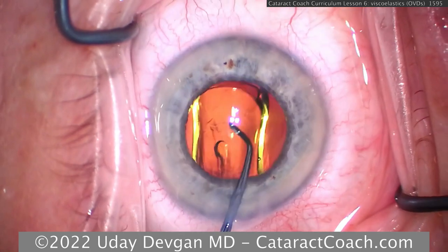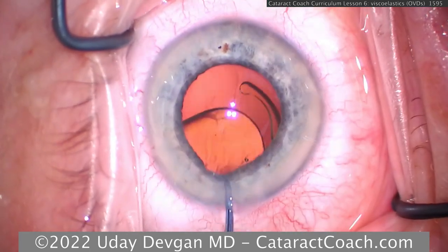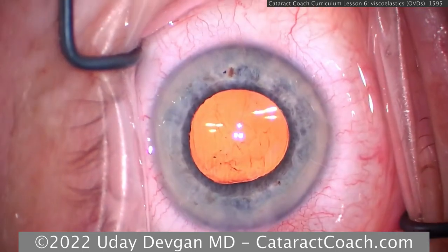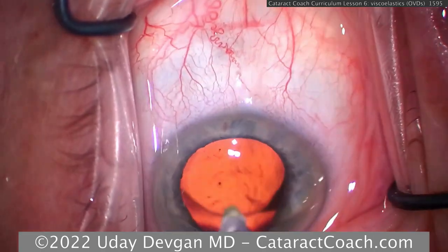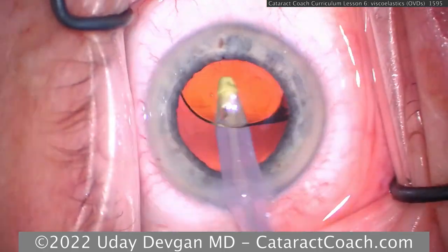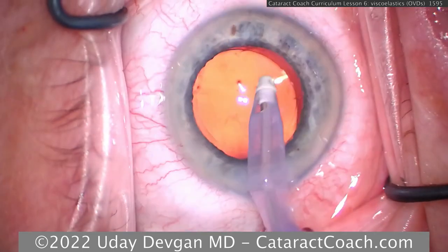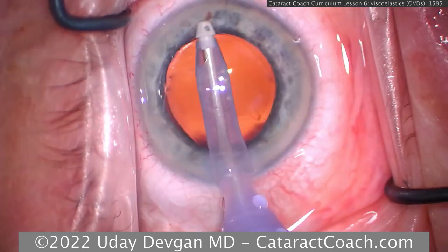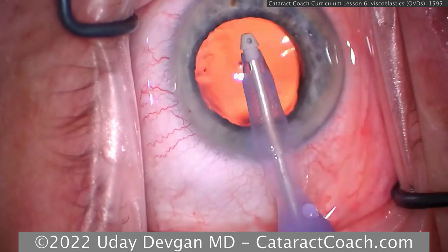Now we've got about a 5 or 5.5 millimeter diameter capsulorhexis. That's a 6 millimeter optic. So do we need to actually go around the capsulorhexis and under the IOL optic to get at viscoelastic like this? Notice how the IOL is lifted towards the ceiling of the room or towards the apex of the cornea. And once we remove the viscoelastic from behind the IOL, then we can clean up the anterior segment and remove the viscoelastic from the AC as well as the angle of the eye.